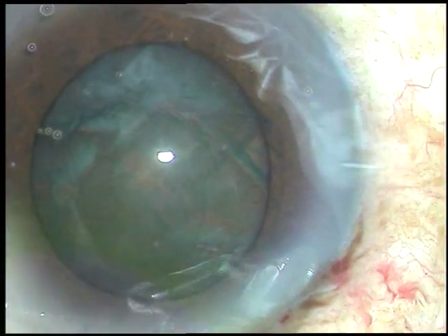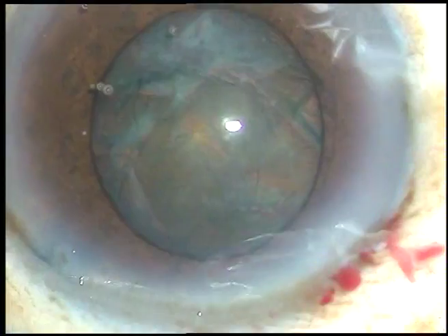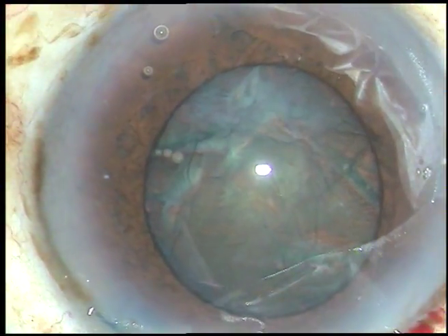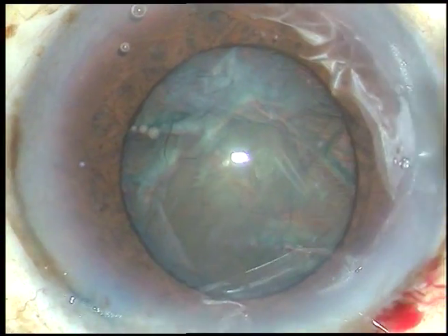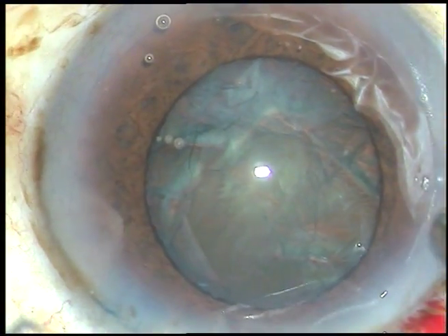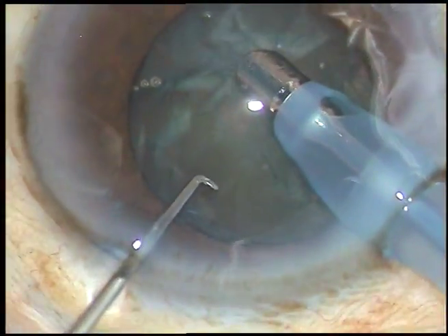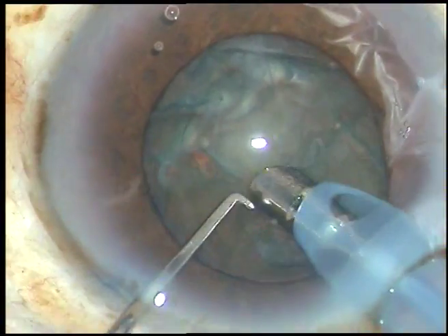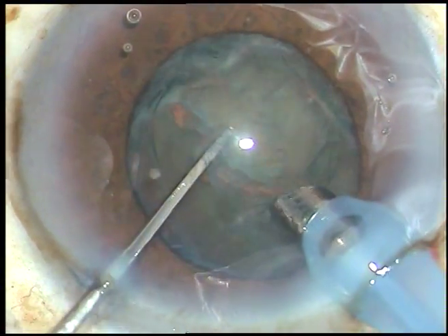Again, viscoelastic substance is injected, and now is the time to introduce the phaco handpiece. The machine being used is the Alcon Centurion. The patient is under topical anesthesia. See what happens during emulsification of the nuclear fragments.